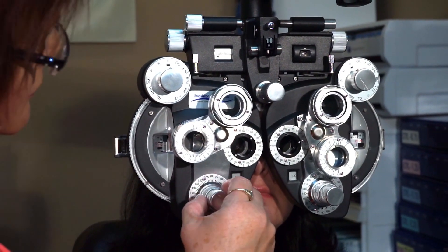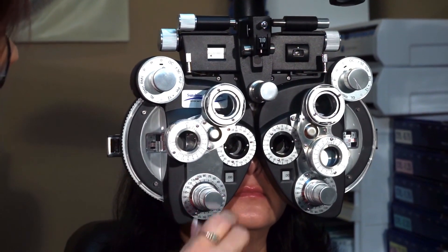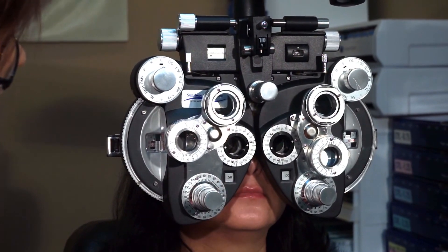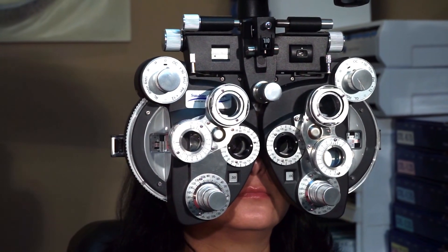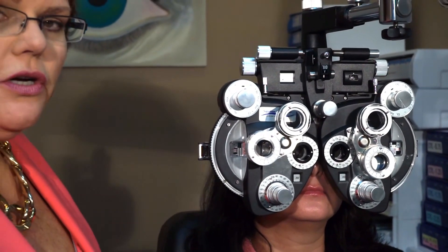Let's see if she needs any cylinder around axis 180. Sharper with one or sharper with two? Two. So she does want some cylinder around axis 180. I think her axis is somewhere around 180, but I don't know exactly where it is and I don't know exactly how much cylinder power she needs.